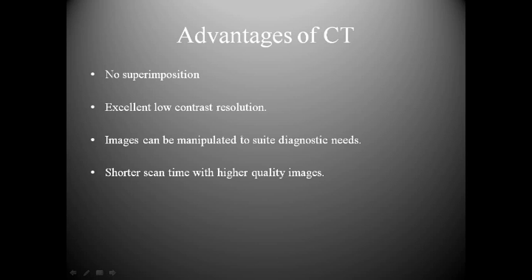So that brings us to the advantages of CT. Number 1, there's no superimposition. You don't have to worry about that any longer. Also, excellent low contrast resolution. Images can be manipulated to suit diagnostic needs. Shorter scan times with higher quality images. This is what we have strived for, to produce high quality images that provide great assistance to the patient and the radiologist and any other physician that might be looking at these scans. And then do this in a shorter amount of time.